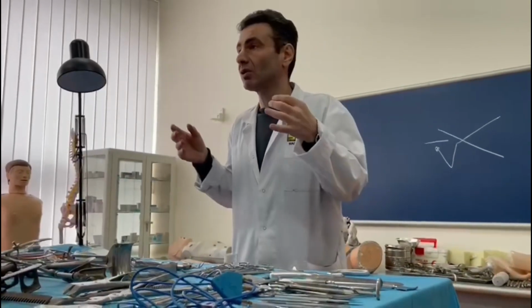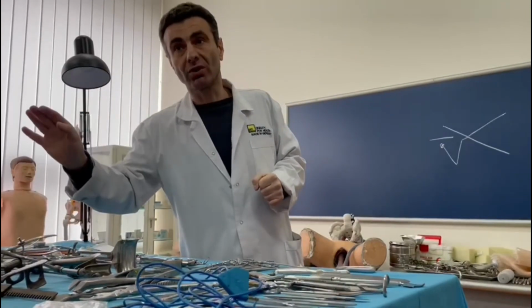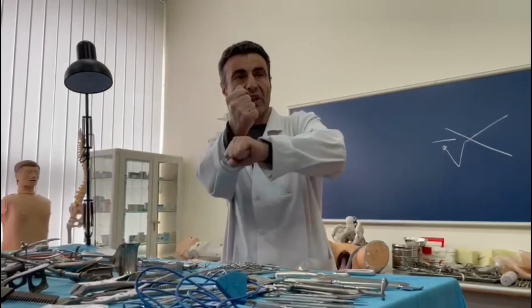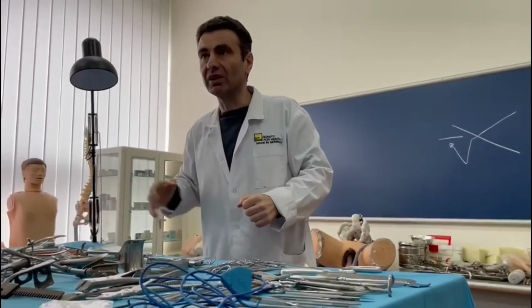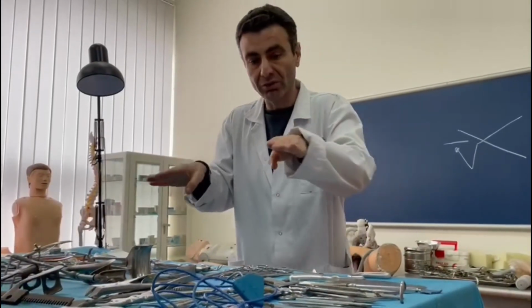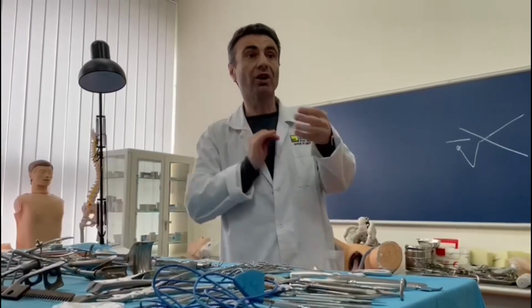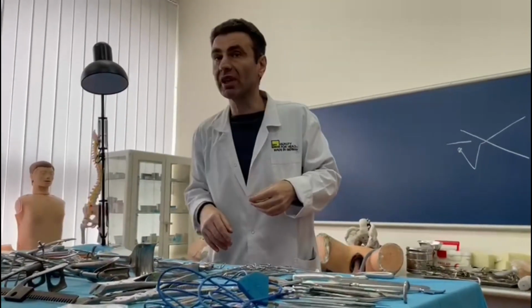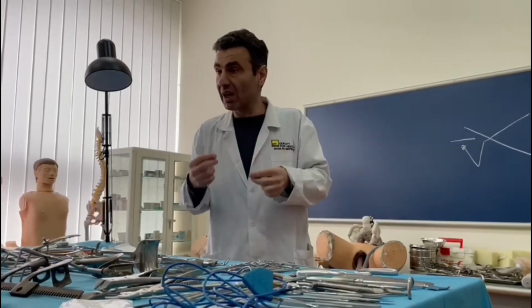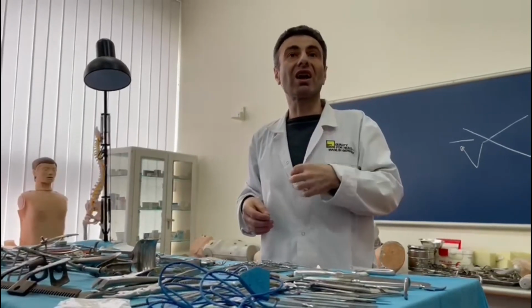Let's say the last year's rule said that sutures should be enough strong. Because if I say maximal strong, you will imagine that I tie the thread so much that it will cut everything. What does enough strong mean? Again, to give a good gripping of the two margins to each other for future regeneration and prevent passage of some organ contents outside. This means enough strong. Especially enough strong sutures are necessary for movable structures or for structures under tension.